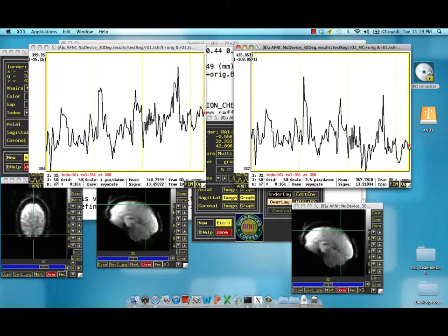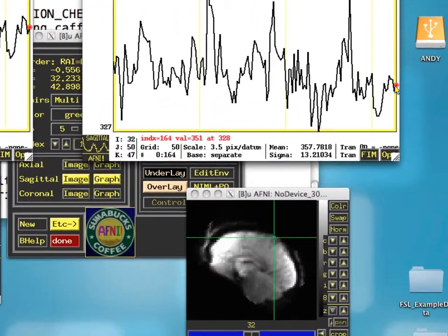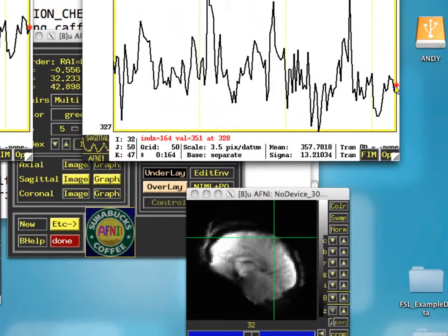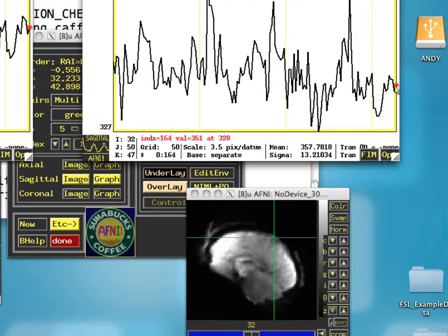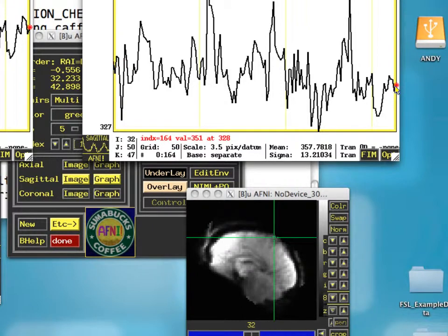Now we look at the motion corrected data set, and we go at the very end time point and go to the very beginning, and there's almost no discernible motion. So this is what volume registration has done.